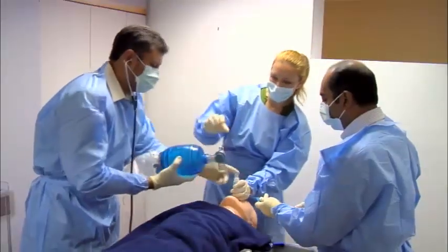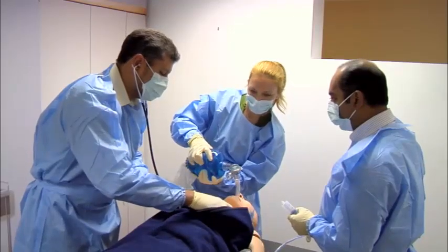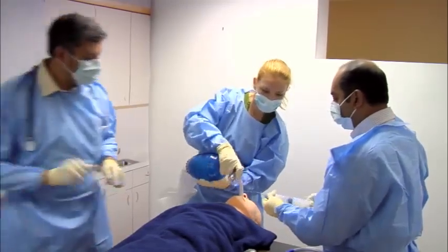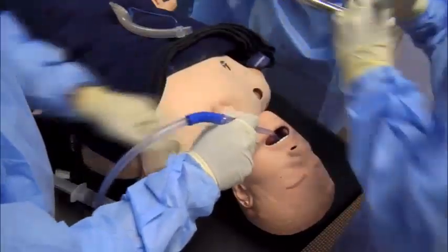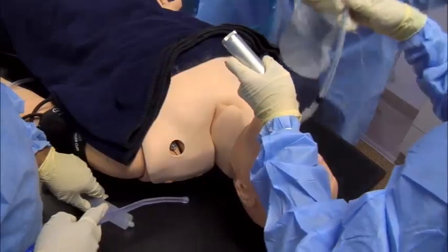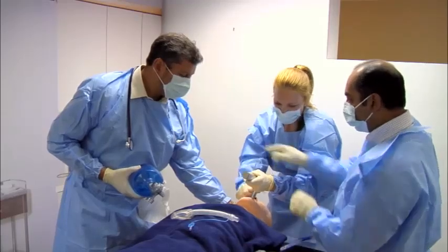Should an LMA be ineffective in securing an airway, consider endotracheal intubation with a laryngoscope and direct laryngoscopy. Still no chest rise. I'm not getting through. Let's prepare to intubate the patient. Take the cuff down. The surgeon may choose the laryngoscope blade he or she is most comfortable with, but should have multiple sizes available. Okay, tube's in. Take the stylet.